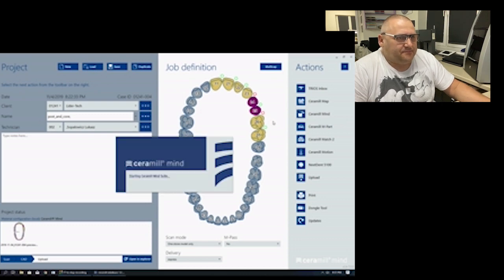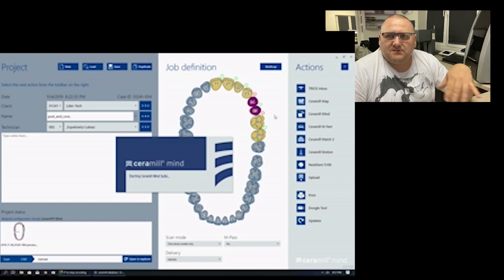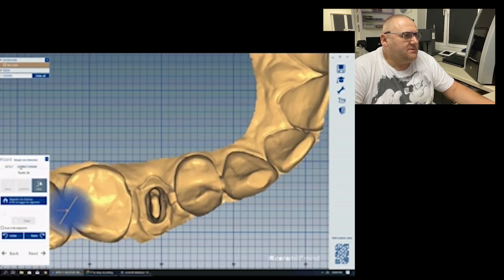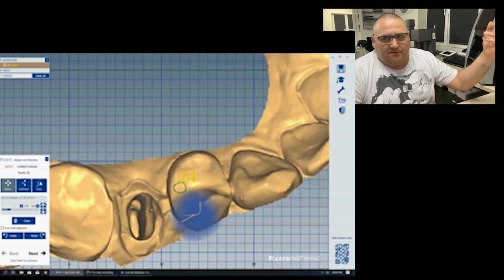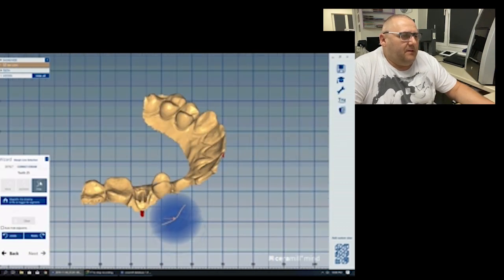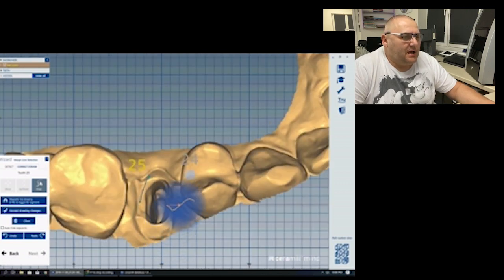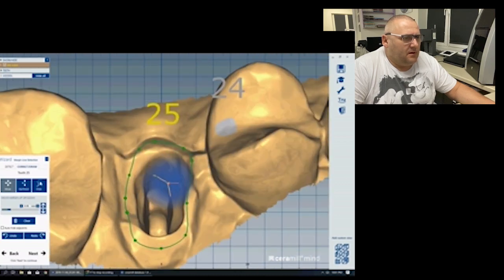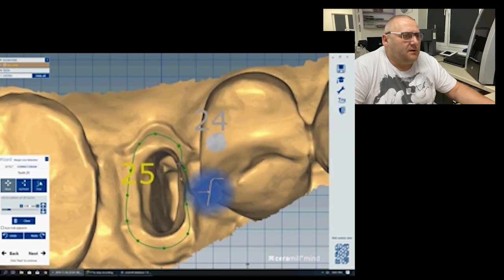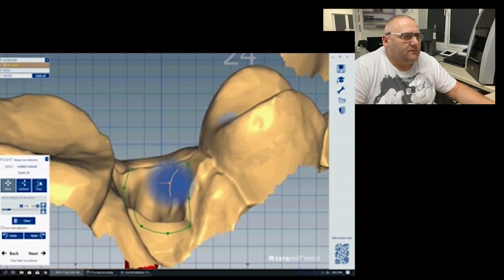We start to design. Of course we focus on tooth 25 because this is the most important — to make a good restoration on this tooth, not on tooth 24. We need to set something on tooth 24 — nothing significant, just something, anything you want. And then we need to set the margin line on our tooth 25. This is only for demo, so I don't make it so carefully.